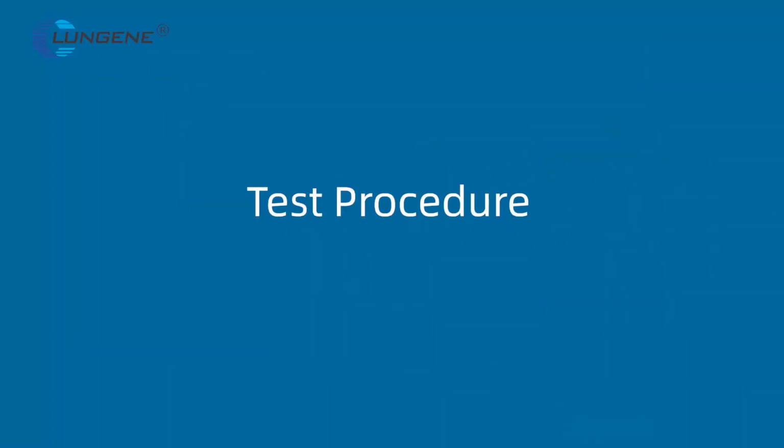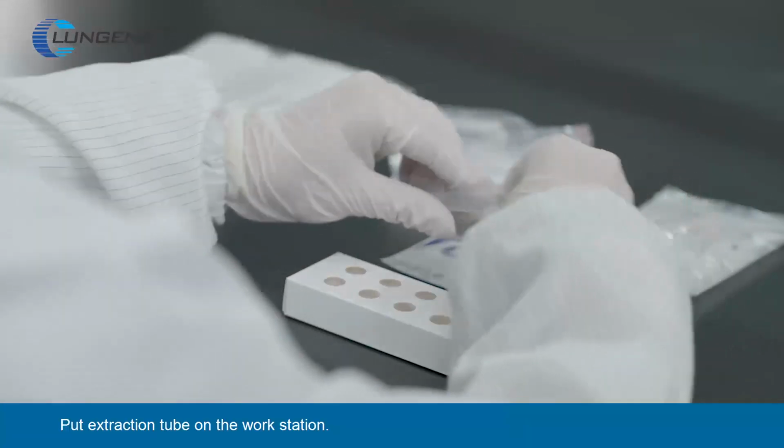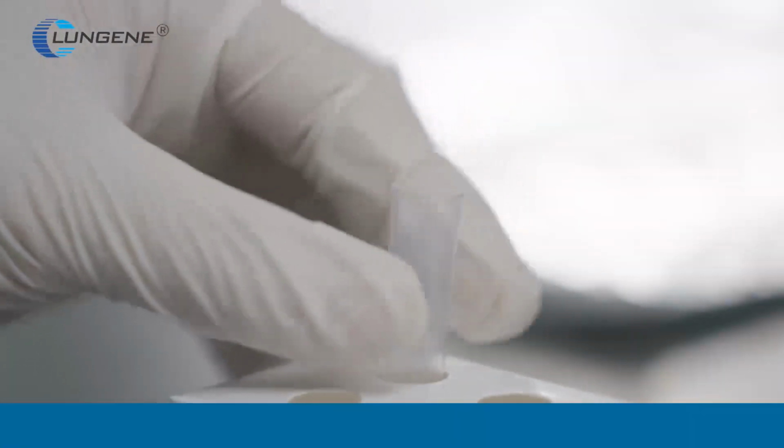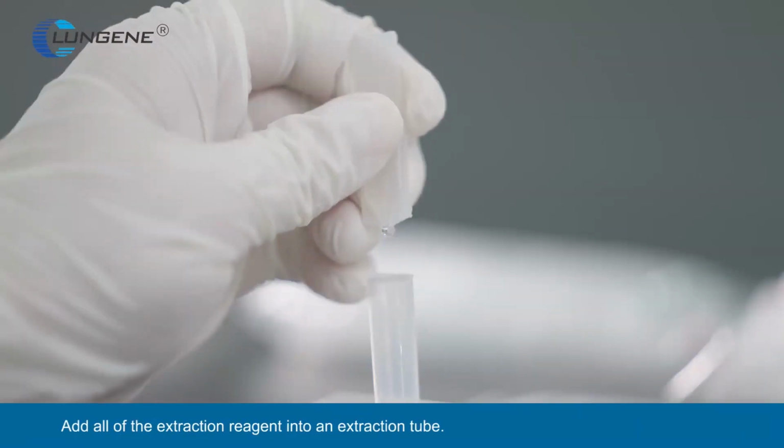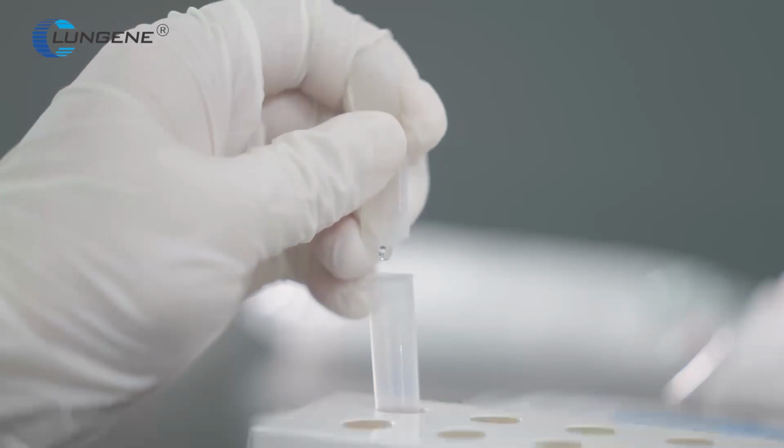Test procedure. Put extraction tube on the workstation. Unscrew the lid of an extraction reagent. Add all of the extraction reagent into the extraction tube.